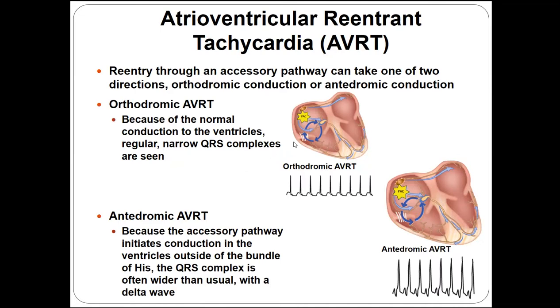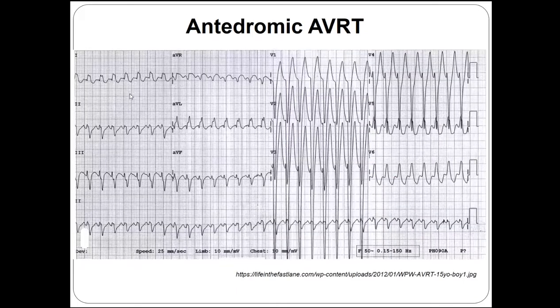The patient can stop it by carotid massage, altering the AV conduction, and that can cut this re-entry cycle, and immediately it'd be normal. This is how it looks. That's an antidromic one, because it looks like a ventricular tachycardia, but you know that at rest the patient has the delta wave and suffers from WPW. So you can assume that this patient does not have a ventricular tachycardia, but WPW syndrome. And if the tachycardia can be stopped by carotid massage, for sure it is a supraventricular tachycardia. It's not ventricular, because a ventricular one cannot be altered.